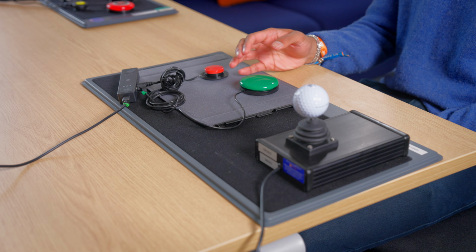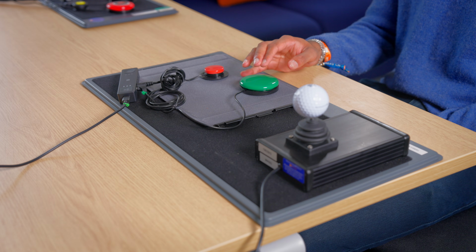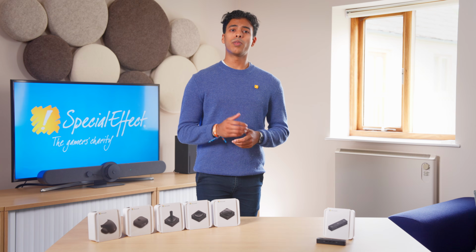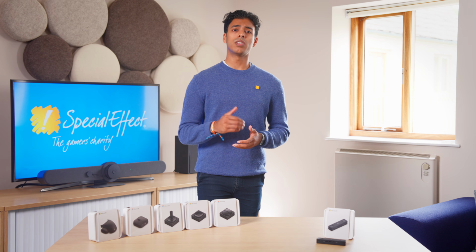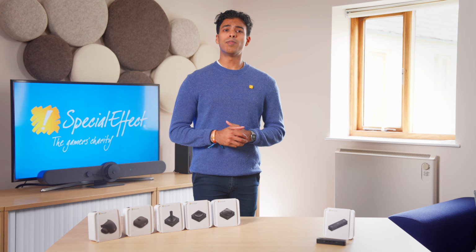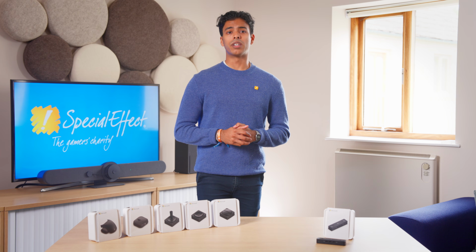You can see how the mouse is moving up when I hold the switch, but now that I let go and hold it again, the cursor is moving to the right. When I let go and hold it again, it moves the cursor downwards. And finally, when I hold it again, it moves the cursor to the left. You can use this to move the mouse around the screen using just one switch.